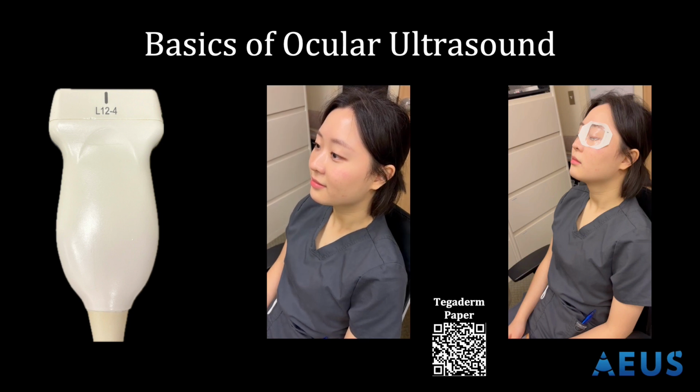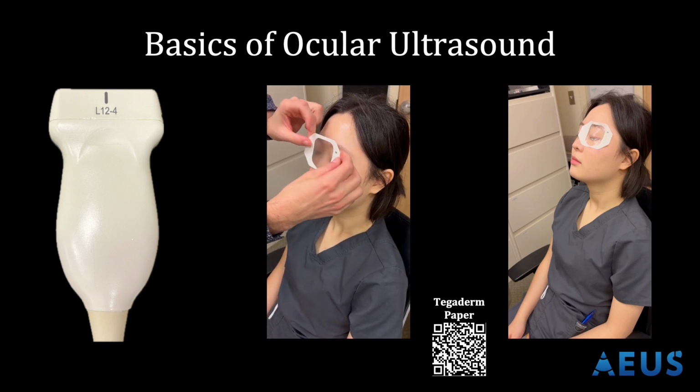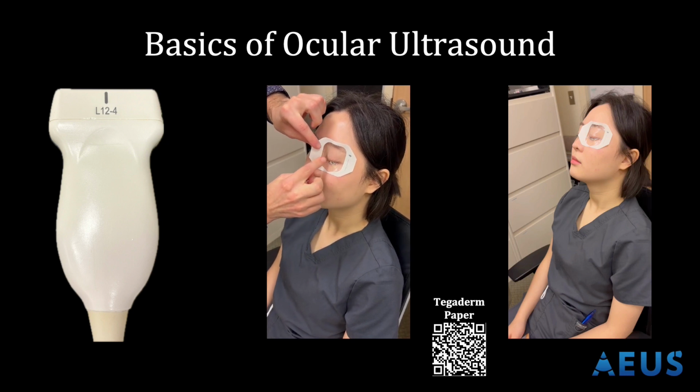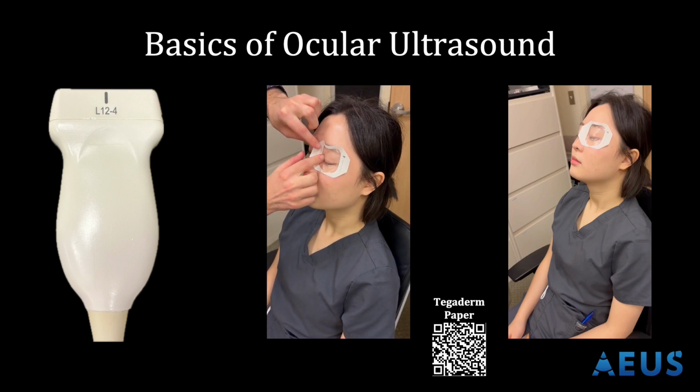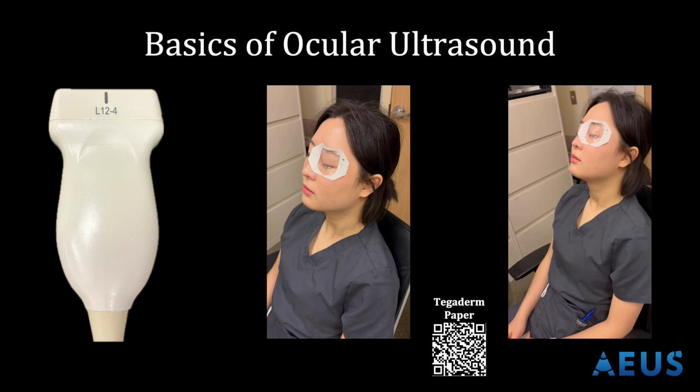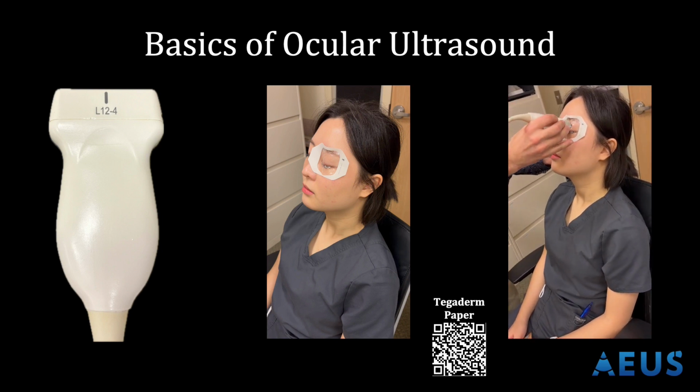The video here shows the placement of a Tegaderm on the eye. You want to ensure that all of the air is removed to create a good quality image. Additionally, this exam requires a lot of gel to decrease the pressure needed to be placed on the eye and to ensure adequate probe contact. The video on the right shows hand placement.